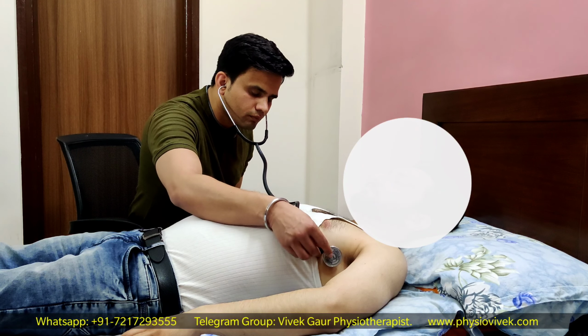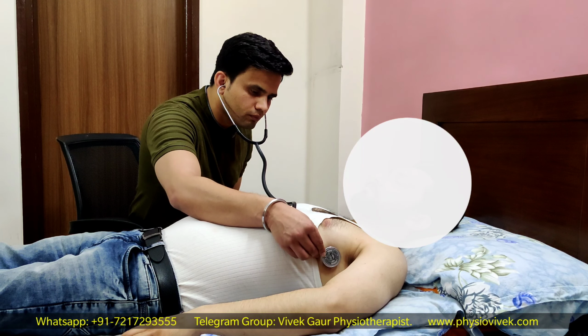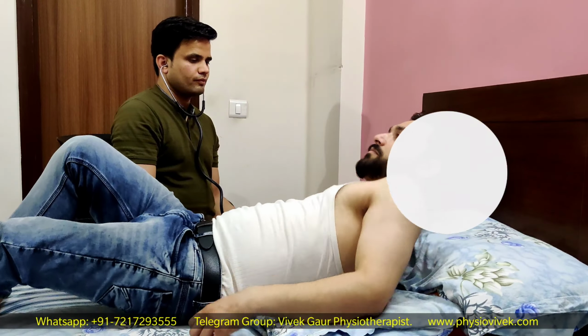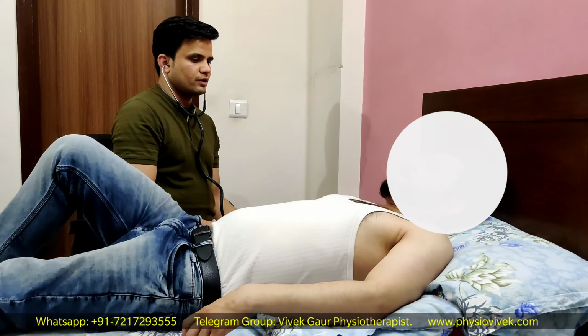Now place the bell of the stethoscope in the patient's axilla. If a patient is having mitral regurgitation, the heart sound of mitral regurgitation, which is a very particular murmur, might actually radiate towards the axilla. Now place the bell over the clavicle bone and listen clearly for any heart sound that is originating from here.